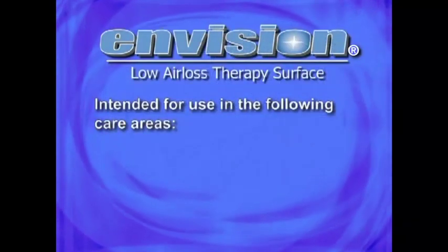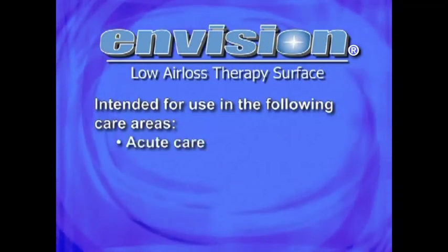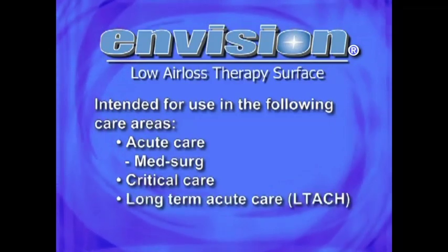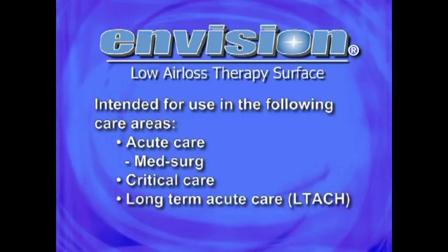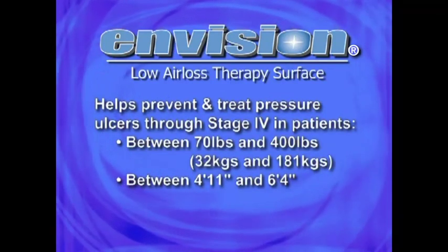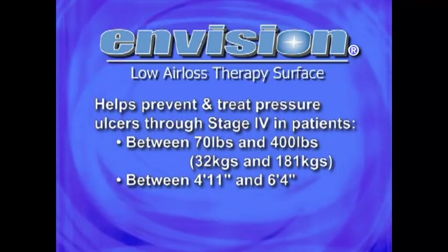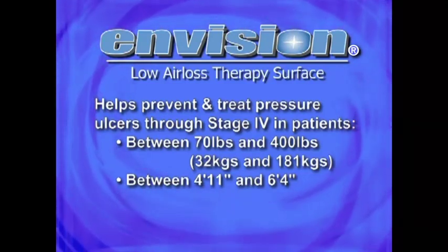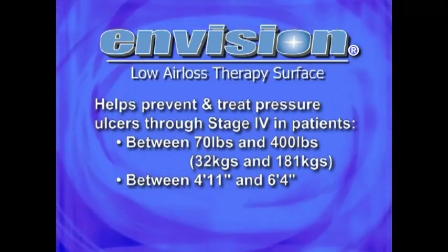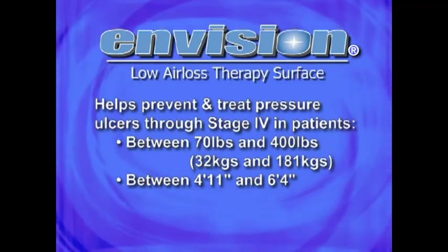The ENVISION Low Air Loss Therapy Surface is intended for use in the following care areas: acute care, primarily med-surg, and critical care, as well as long-term acute care, or LTAC areas. The ENVISION Low Air Loss Therapy Surface helps prevent and treat pressure ulcers through stage 4 in patients who weigh between 70 pounds and 400 pounds, or 32 kilograms and 181 kilograms, and who are between 4 feet 11 inches and 6 feet 4 inches in height.